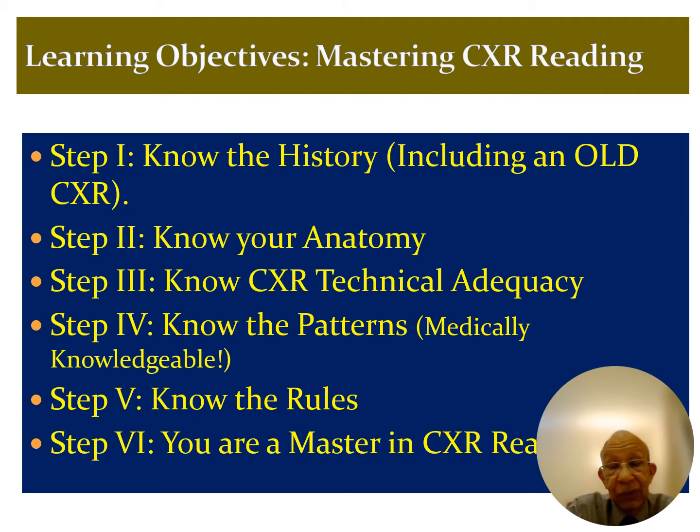The second step is you really need to know and master the anatomy of a chest X-ray. The third step is about assessing the chest X-ray technical adequacy. The fourth step is knowing the patterns. Unfortunately, many diseases have similar patterns, and therefore you really should be medically knowledgeable to be able to identify these patterns and differentiate between them.